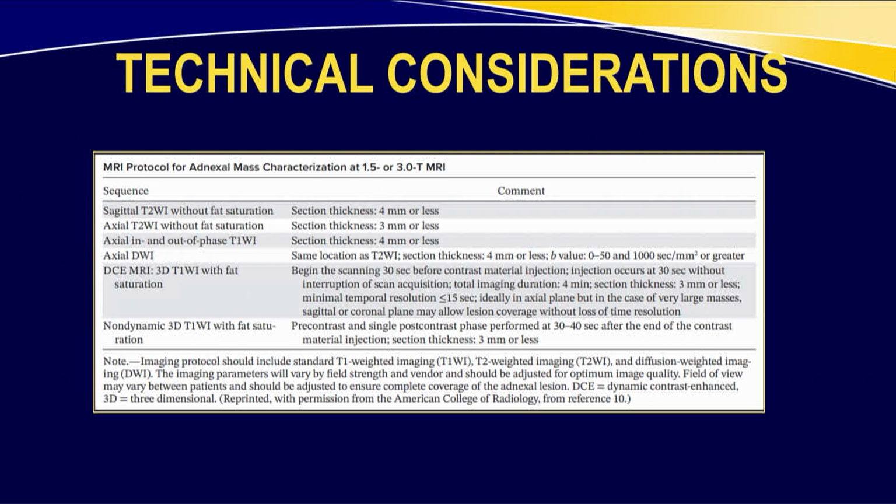What are the technical considerations? And this is from the ACR website. I would counsel you, if you don't have a usual protocol that you use or you want to get more familiar with it, this is on the ACR website.